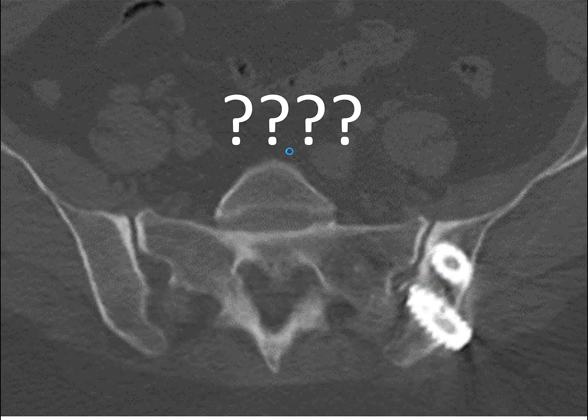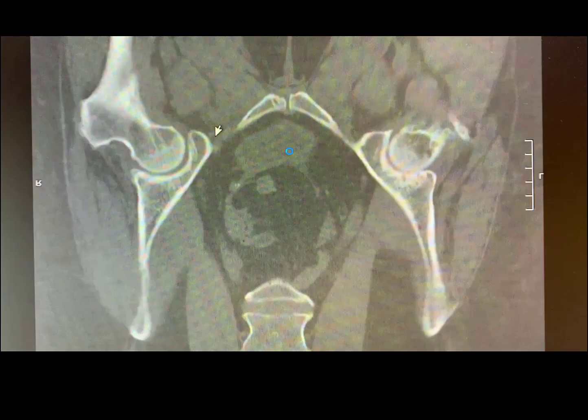Yeah, well, I was doing originally a block window out and going directly in. And then this hospital was incredibly helpful for me. I did about a dozen or more of these in the CAT scanner. I put an operating room in the CAT scanner, prone, and what I would do, this isn't the best cut to show it, but I would make an incision over the posterior iliac crest and obtain a bunch of posterior iliac bone.